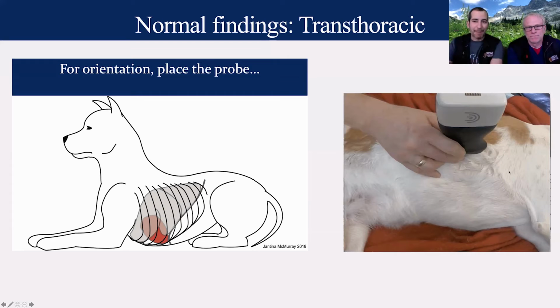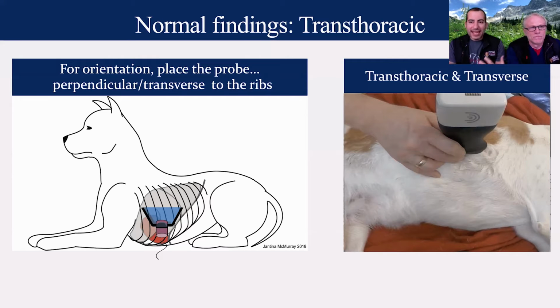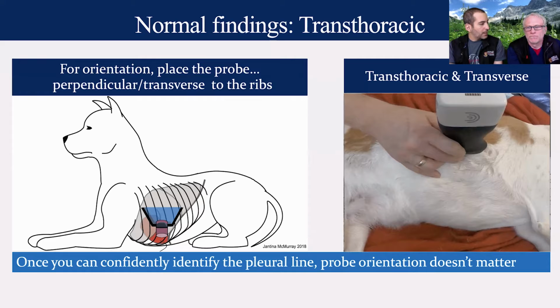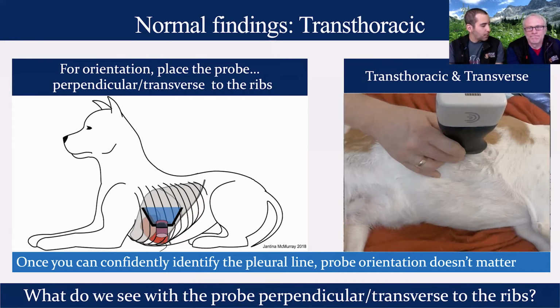We're going to talk about that pattern recognition. But if we were to do that, Dr. Boysen, we have to think about what we're going to see. Beginners, this is a great thing because it's all about pattern recognition. But if you do this for the first time, Dr. Boysen, you've never done this before and you're used to the abdomen, looking at all those beautiful kidneys, the bladder, the kidneys. There are no kidneys in the thorax, Dr. Chalhoub. If there is, you have a serious problem. It's not impossible, but it means there's really bad pathology. So we're not looking for kidneys, Dr. Chalhoub. Put that perpendicular to the ribs.